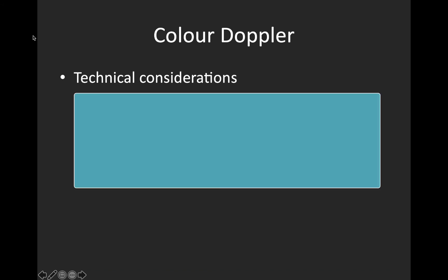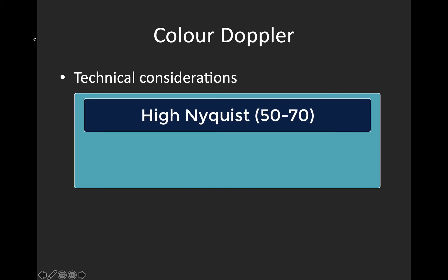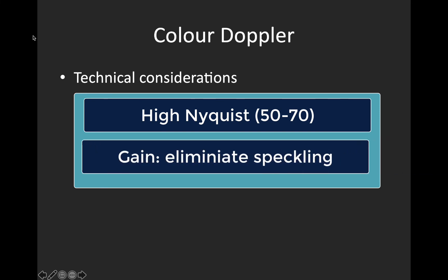Generally the color presets on your machine are pretty good on the cardiac setting, but you can adjust your Nyquist limit, your PRF, and your gain. Note that in the heart we want a high Nyquist limit, as we're interested in high velocity blood flow.